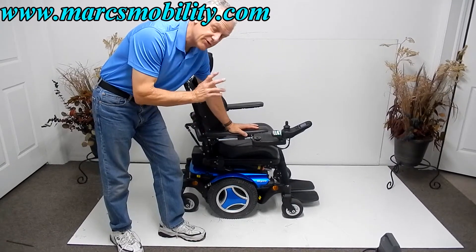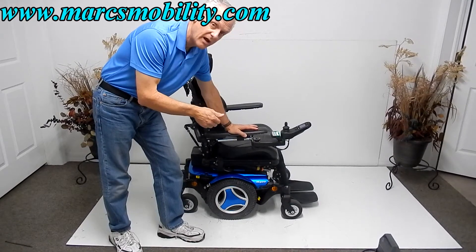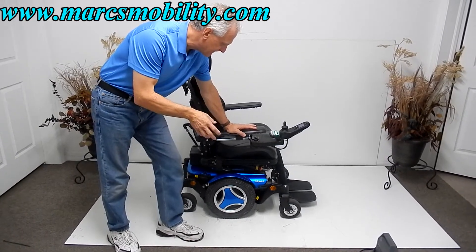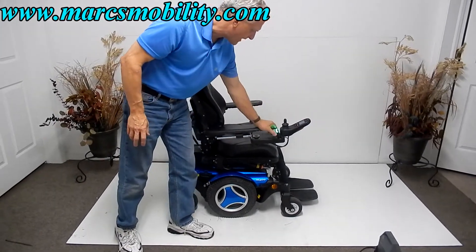This Permobil has an electric seat lift of eight inches, electric tilt, electric recline, and electric legs. All the functions can be worked through the joystick or through the box behind here.